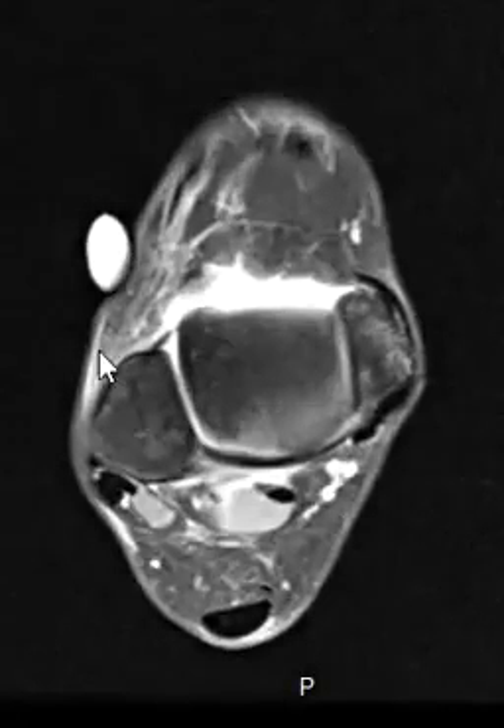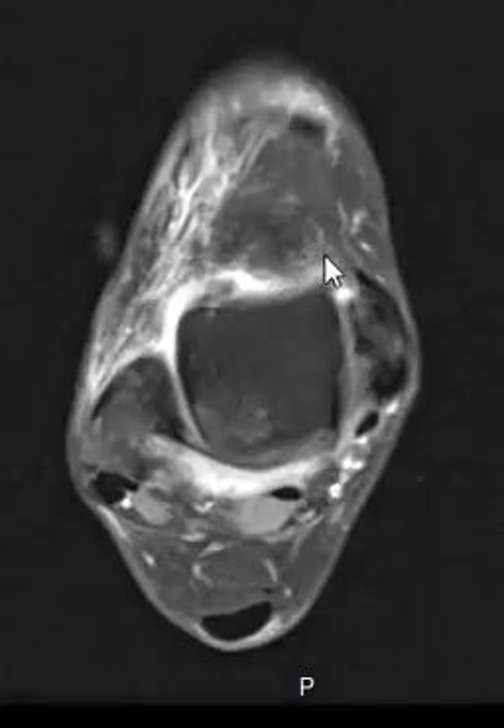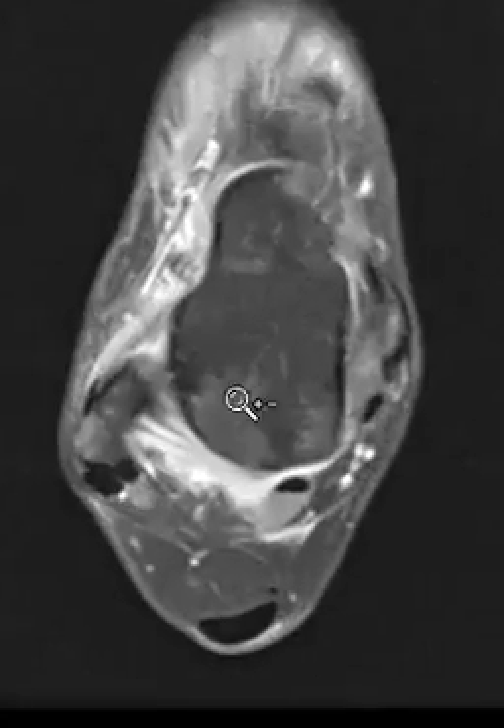This patient has a marker right here — this white thing is a skin marker placed over the anterior and lateral aspect of the ankle, right over where they are hurting. Looking here, we can see something that is abnormal.